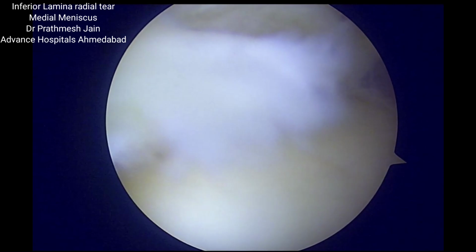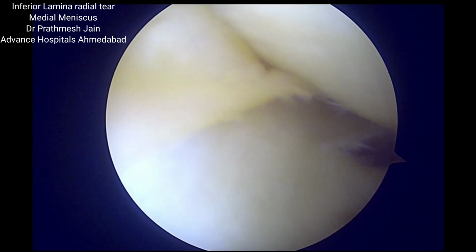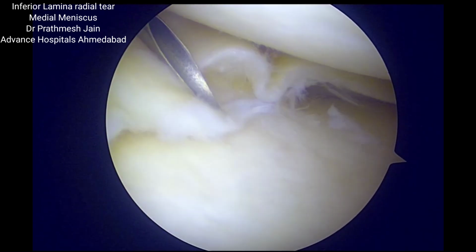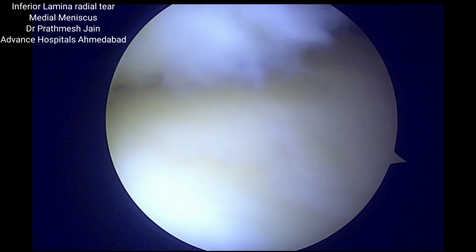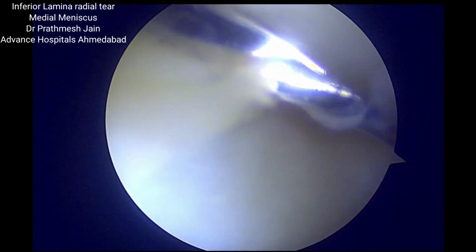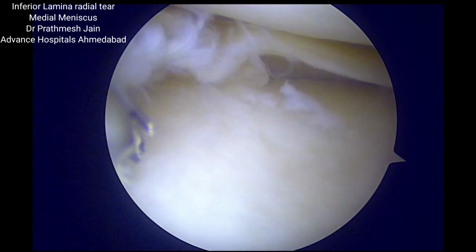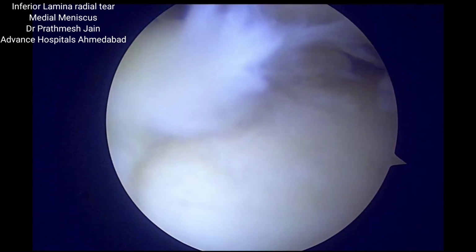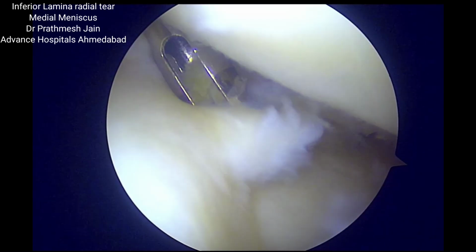So what we do in this scenario is either we can use a box stitch technique, or we can use an anchor with a side to side margin convergence equivalent repair. So we make a high anteromedial portal, and with that we insert an extrusion repair anchor. Now this is a special anchor, this is an all suture anchor. It is customized for this particular sort of repair.